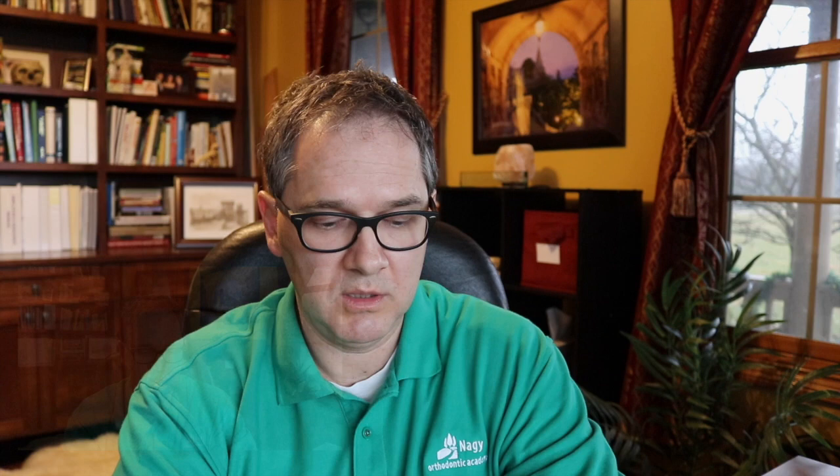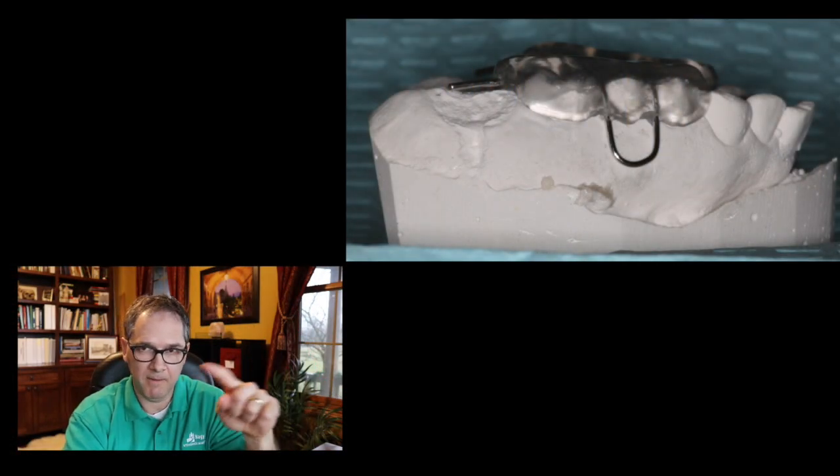These acrylic expanders are cemented in, and they can be quite difficult to remove unless you fabricate them in a way that allows easier removal. There was an article by Dr. Sarver where he puts loops into these acrylic expanders — small loops between the five and four that you can grab with a Weingart to take the expander off more easily. You should use a plastic cement and make sure you don't over-etch the teeth, so the expander stays on during treatment but can still be removed when you're done. These Sarver loops will help you remove the expanders if cemented and fabricated properly.